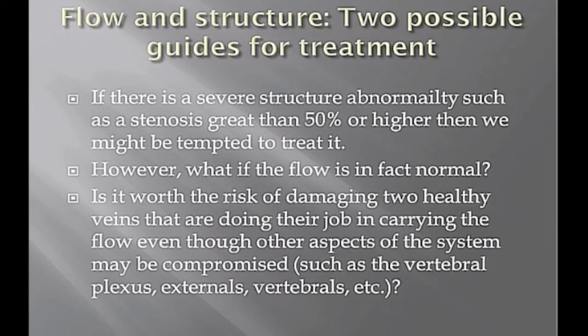So now I want to go back and show something that I think has some very similar parallels to what Robert showed on the perfusion, where he split this up into normal-looking MS patients and abnormal-looking patients and found that the normals had high flow and the abnormals had low flow comparing to CCSVI. So we did something similar to that, where we started looking at the abnormal structures that we saw and then looked at the flow patterns for the MS people who had abnormal structures compared to the MS group that had normal structures.